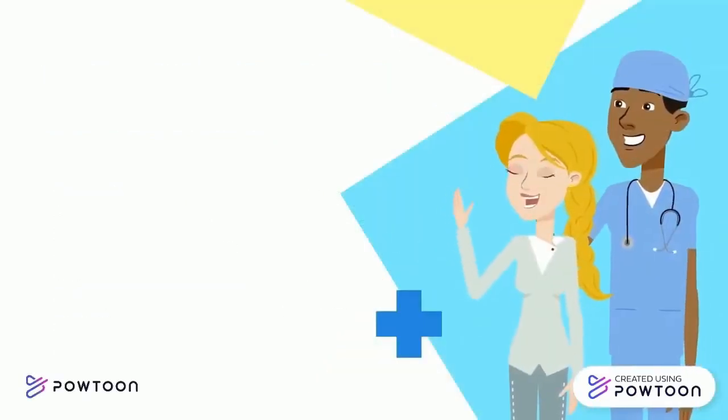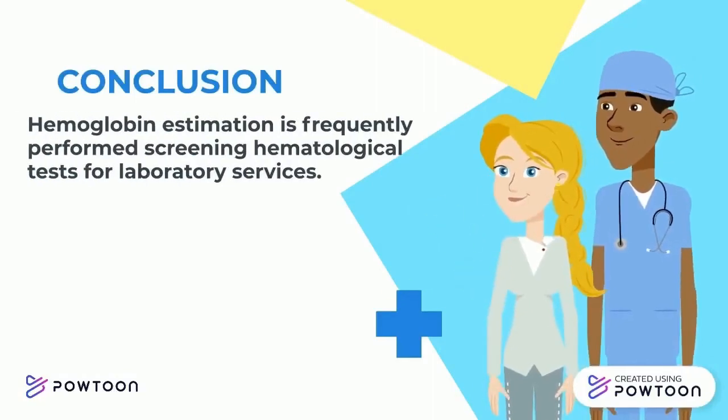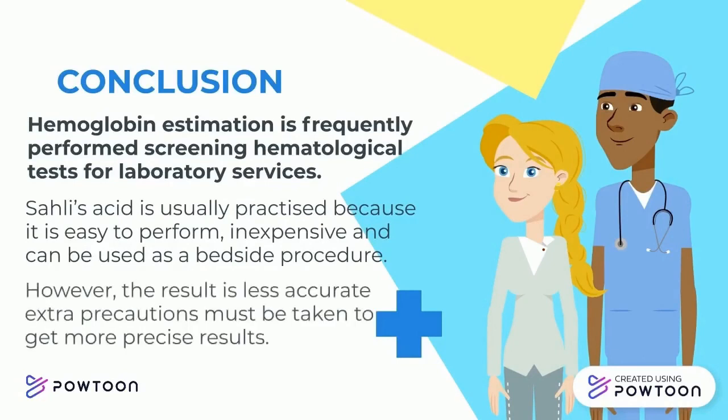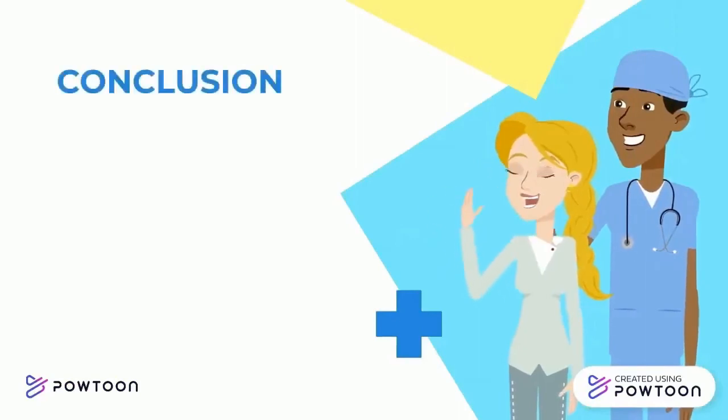I will present the last part, which is the conclusion. As the conclusion, hemoglobin estimation is a frequently performed screening hematological test for laboratory service. Sahli's method is usually practiced because it's easy to perform, inexpensive and can be used as a bedside procedure. However, the result is less accurate. Extra precaution must be taken to get a precise result.